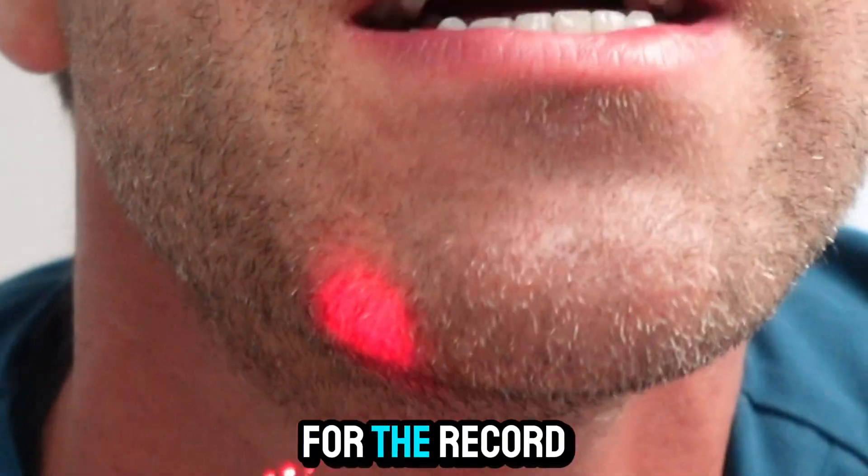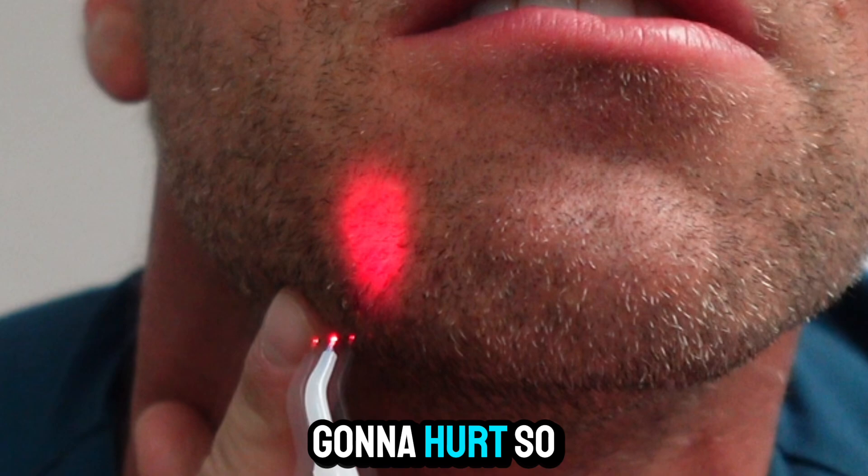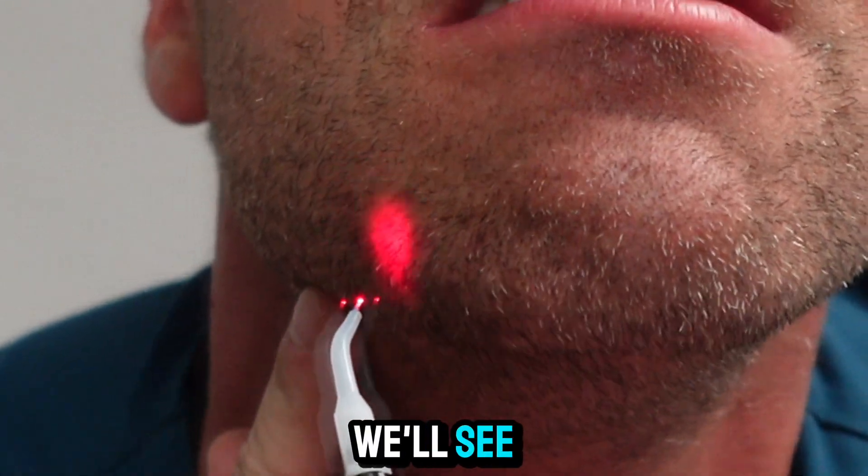My little spot's right there. For the record, I am not numb. I have no idea how this is going to go. This is probably going to hurt so bad I can't do it — but we'll see. Here it goes.